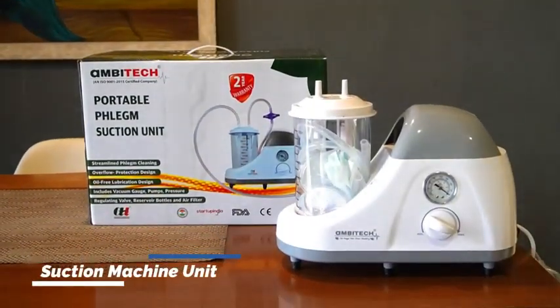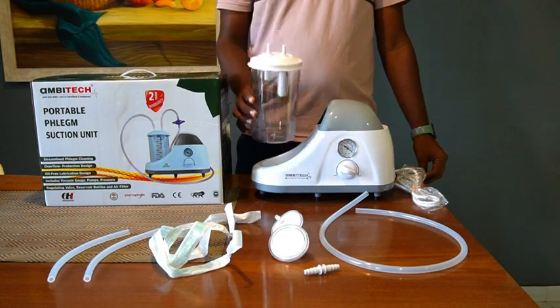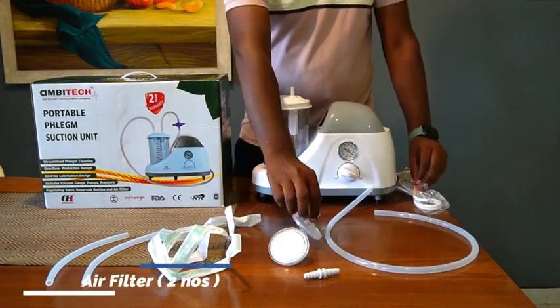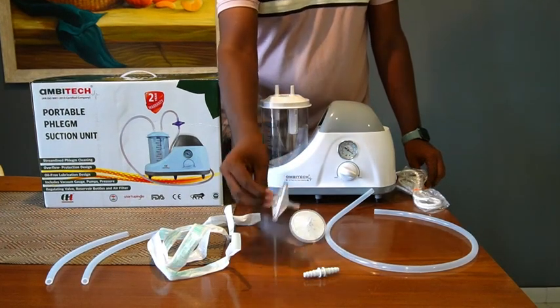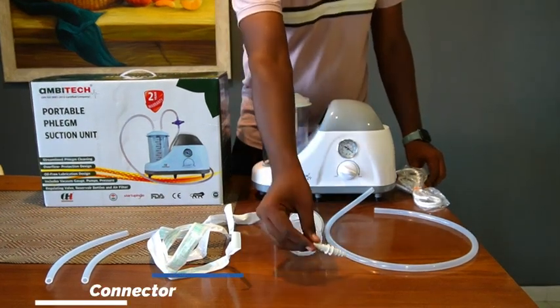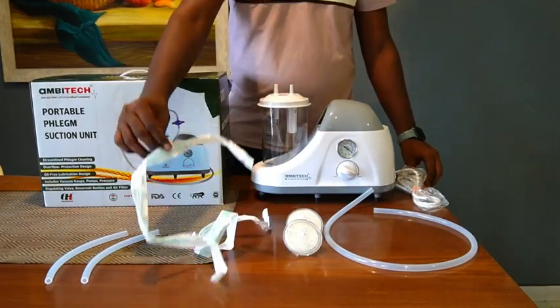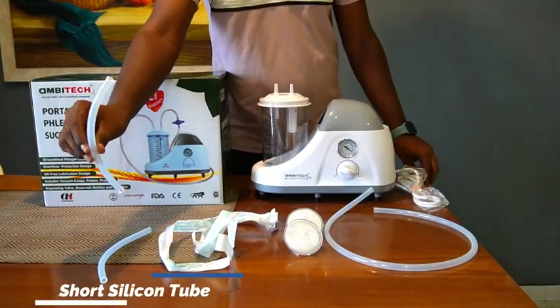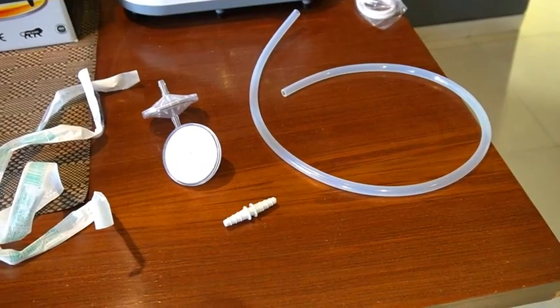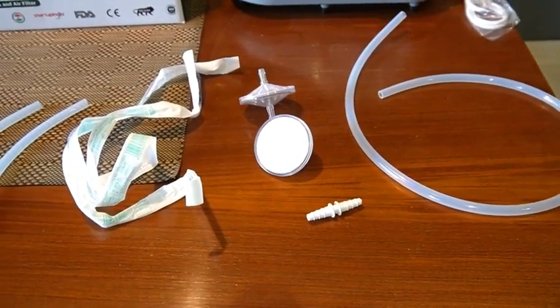Inside the box, you'll receive the following easy-to-assemble parts: the base unit or reservoir, a suction jar, a long silicone tube, an air filter, an extra air filter, a connector, a phlegm tube, an extra phlegm tube, and two short silicone tubes. You will also find a user-friendly instruction manual that will help you to assemble the unit quickly and easily.